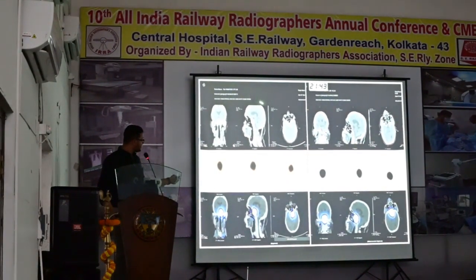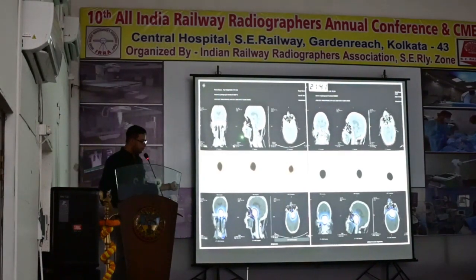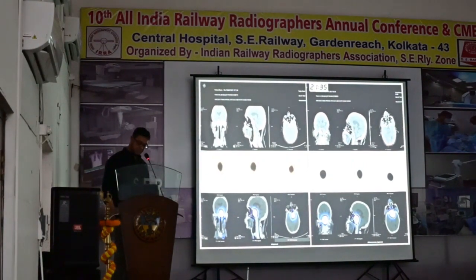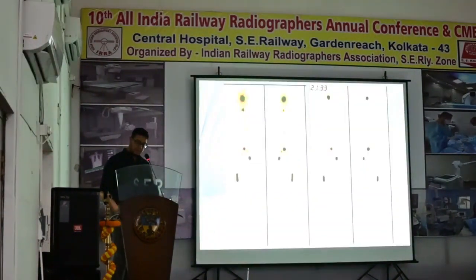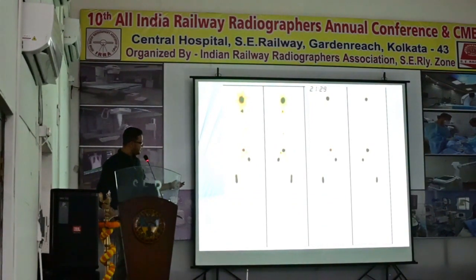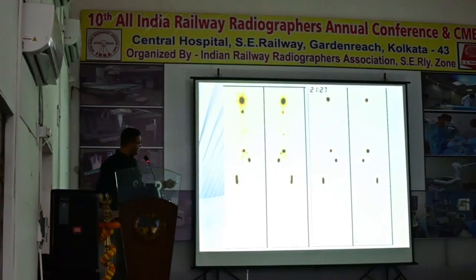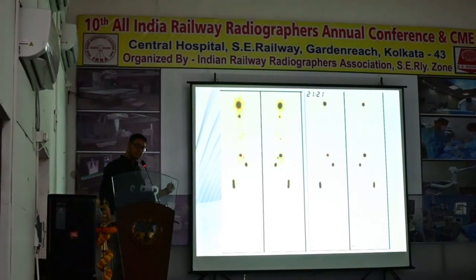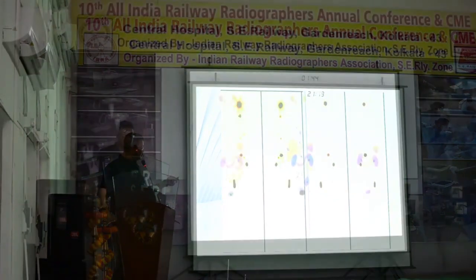And this is the first panel which shows the pre-radioactive iodine therapy image, and this is the post-radioactive iodine SPECT CT scan. Coming back to the previous slide, we see that when we have treated with 2 cycles, these all are gone. There is a decrease in the uptake. You see the star artifact which is showing the excessive amount of radioactive iodine uptake.